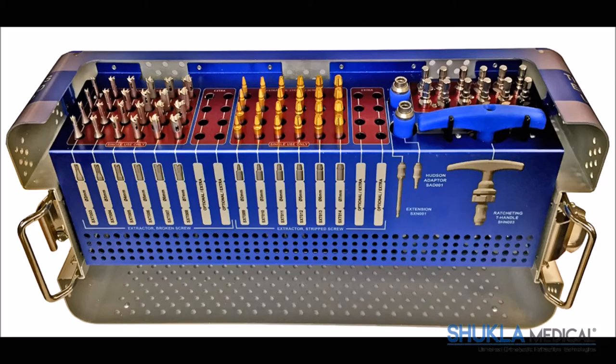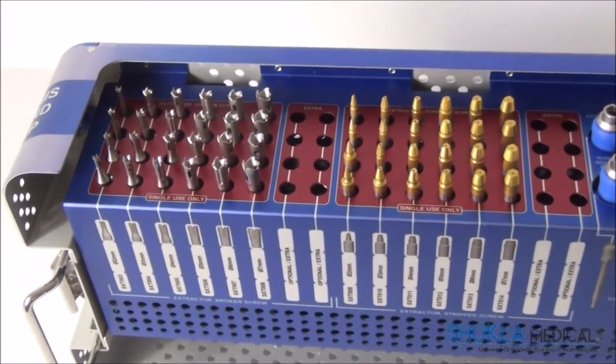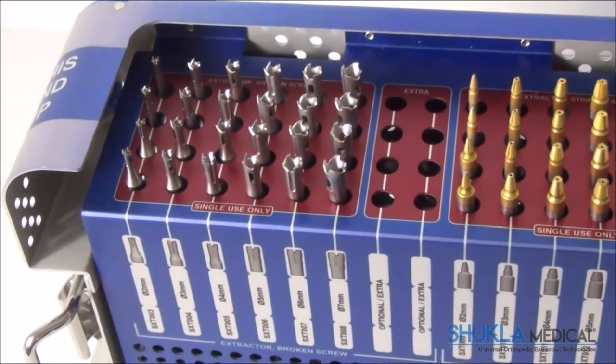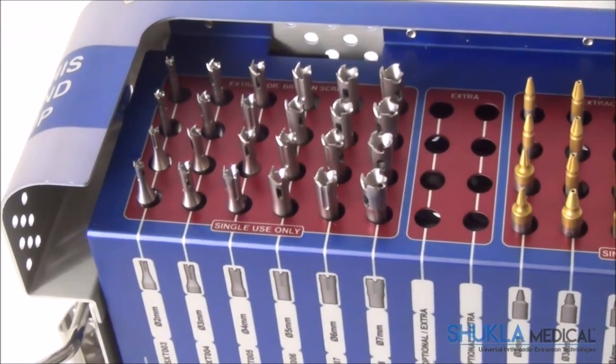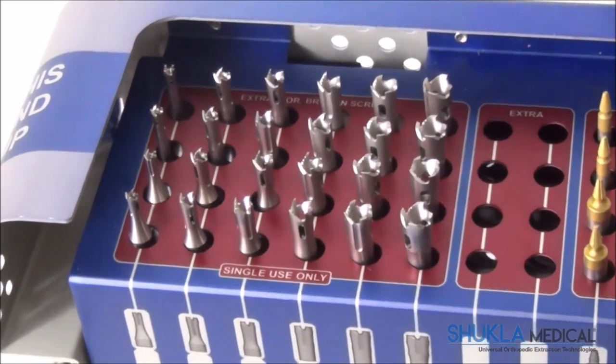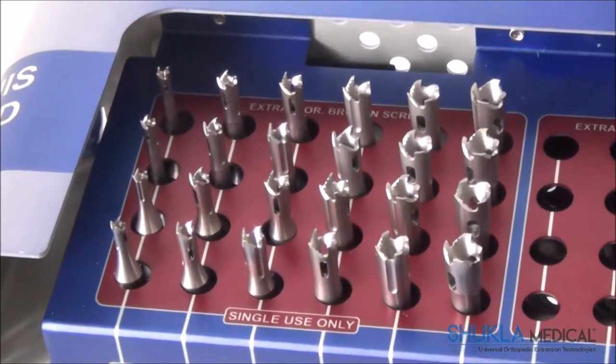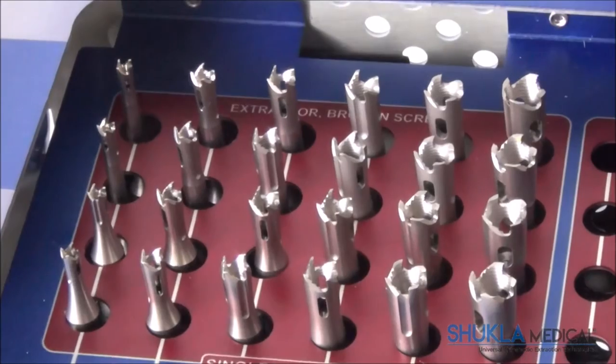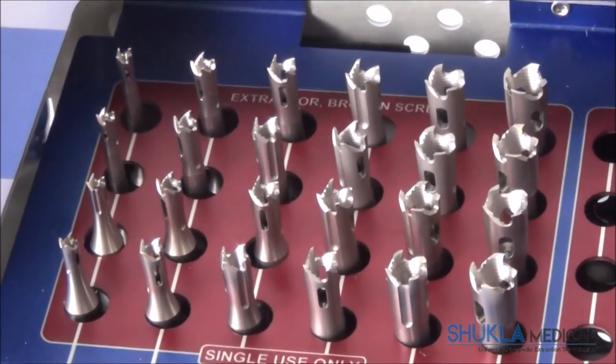The broken extractors sit in the tray to the left, labeled from the smallest size 2 mm up to the largest 7 mm. Since each extractor is capable of removing slightly smaller and larger size screws, the range of usage can actually be extended up to 8 mm in size.